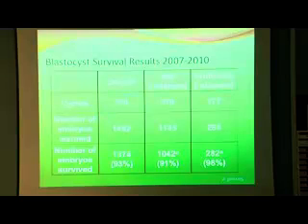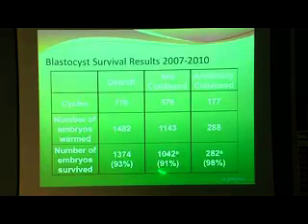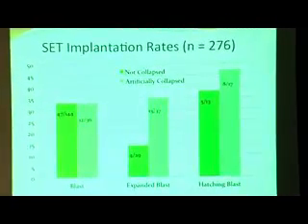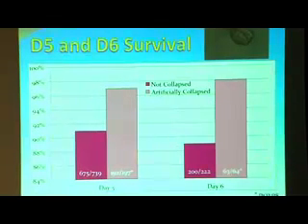The first 3 or 4 years we did almost 800 FET cycles. When we started doing collapsing, we found that our survival increased pretty dramatically, up to about 98% here, compared to only 91% for embryos that we hadn't done this artificial shrinkage for. In particular, the expanded blastocyst stage, those big embryos that weren't doing very well before, once we started collapsing them, now they're doing just fine. And in fact, collapsing seems to help other stages as well. So this is something that we're doing pretty routinely now.